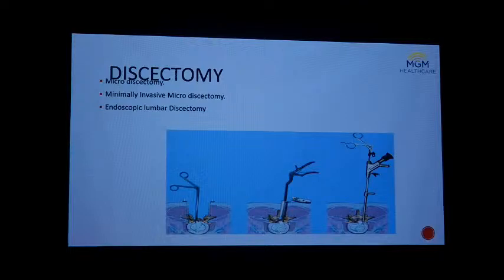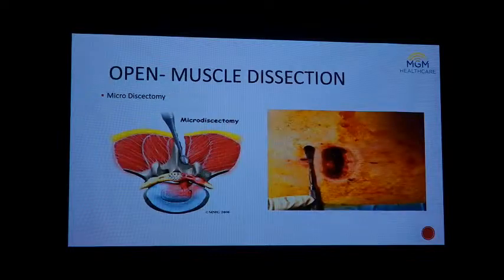All of these are minimally invasive approaches, right from microdiscectomy and tubular discectomy. What I prefer to do is the sutureless percutaneous endoscopic discectomy. Why do I do it? I want to do it a little better than what can be done by the rest, aiming at giving a better quality of life. The bottom line is better quality of life. All these are minimally invasive, but whatever muscles are there are still damaged. The bony structures and the ligamentous structures are all compromised, and having a very small skin incision doesn't really matter.